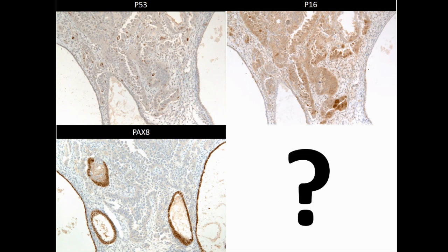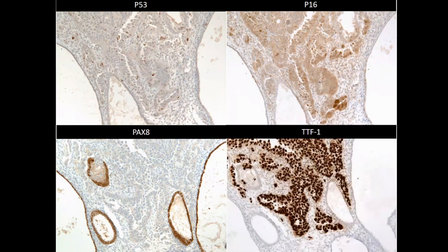which led to a big fat question mark, because what I have here is an endometrial polyp with a very atypical tumor in it. And I'm told that these things are supposed to be serous carcinomas. So I had to reassess, right? Am I going to call this a serous carcinoma, this P53 negative? No, I'm not. So I dug around a little bit. Long and short of it is TTF1 was diffusely positive. Now we're going to circle back around to this, but you should be thinking about other things at this point.